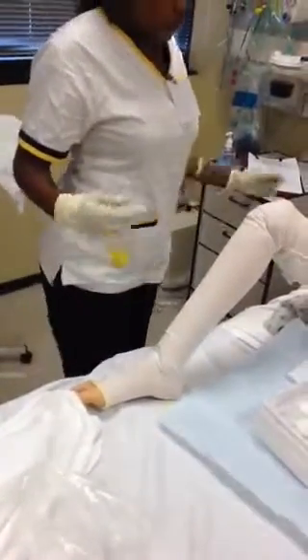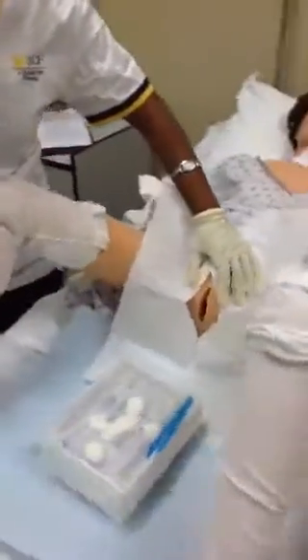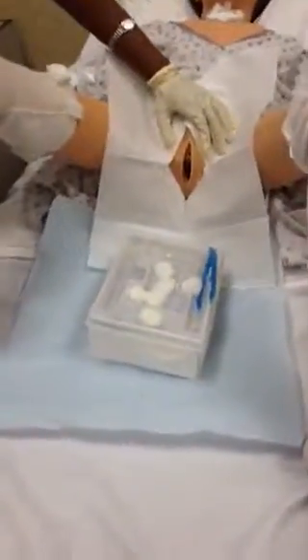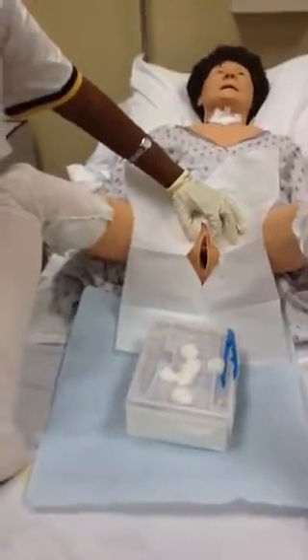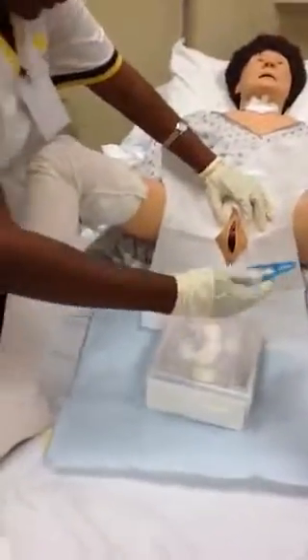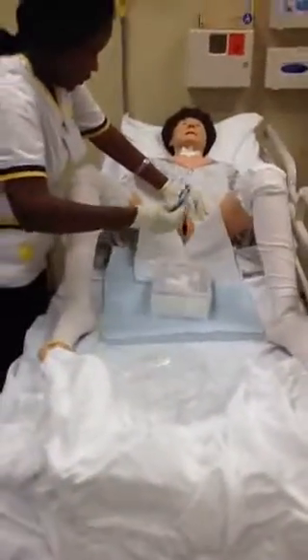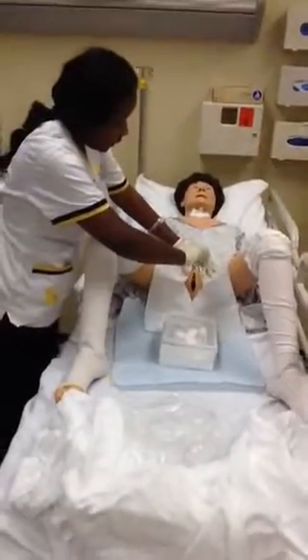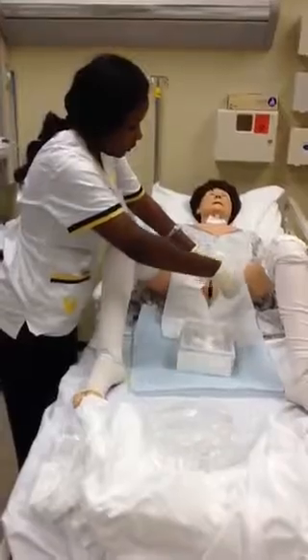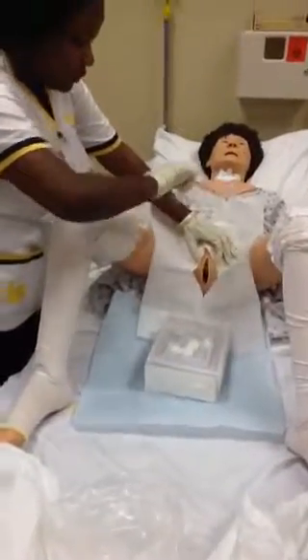Okay. Now I'm going to open the labia. I'm going to do the side that is farthest away from me first. Outer, out, inner, out.